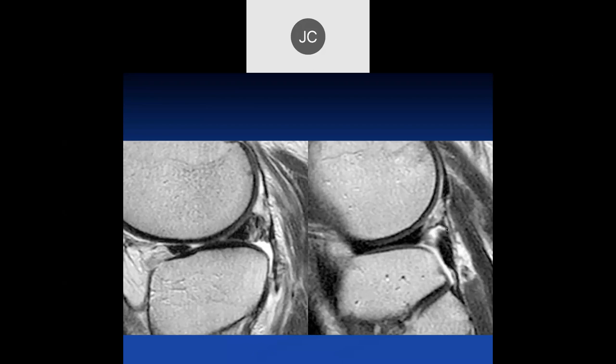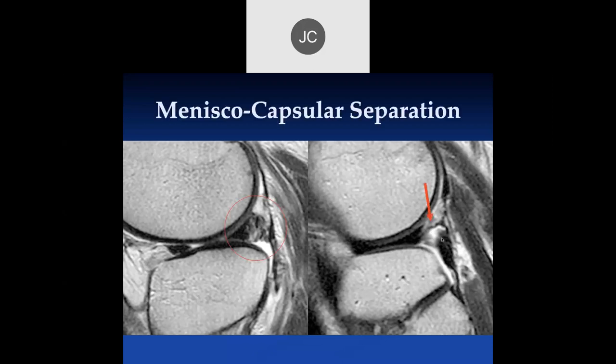We'll probably see a little bit of a feeble superior strut here, which looks very abnormal and thinned, with the popliteus tendon coming underneath it. And surgically this was another meniscocapsular separation with tears of the struts back there.